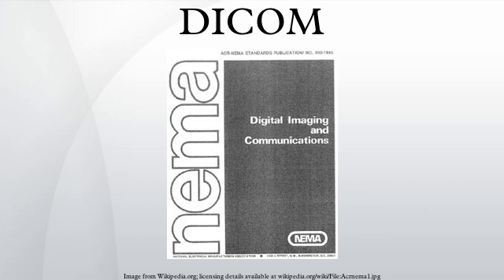Image display. To promote identical grayscale image display on different monitors and consistent hard copy images from various printers, the DICOM committee developed a lookup table to display digitally assigned pixel values. To use the DICOM grayscale standard display function, images must be viewed on devices that have this lookup curve or on devices that have been calibrated to the GSDF curve.